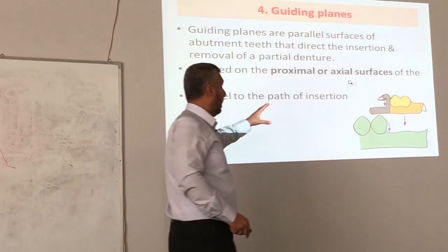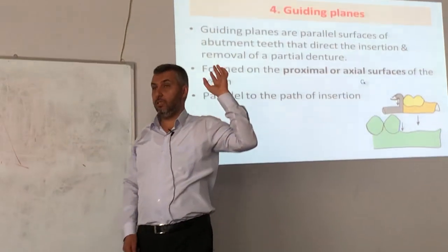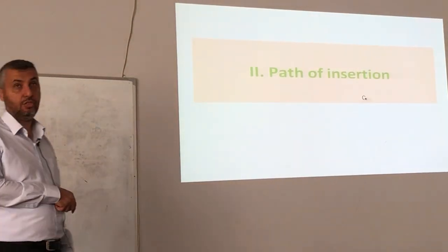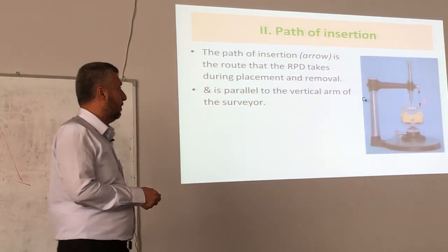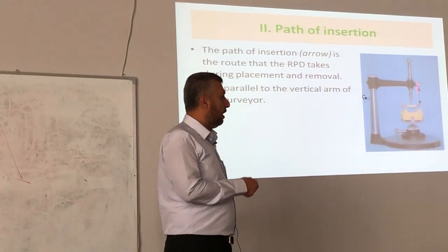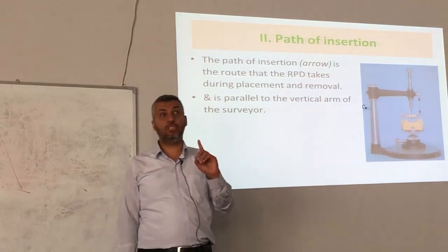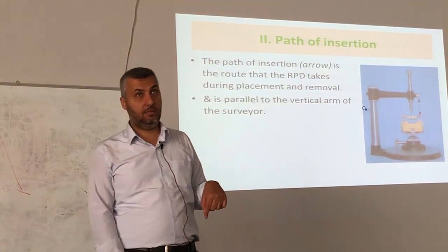The point of the guiding plane, why we take this subject, is because it helps us in case of insertion, the path of insertion, also sometimes called the path of insertion. As you see from this, this is the path of insertion. The path of insertion on the surveyor should be vertical.